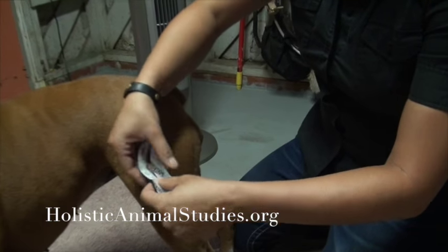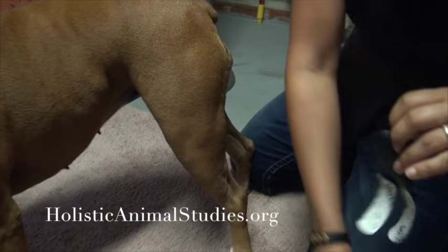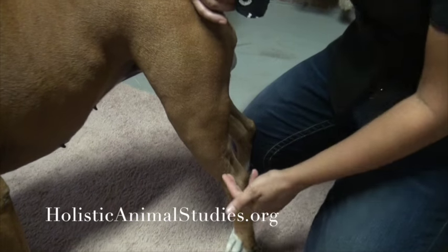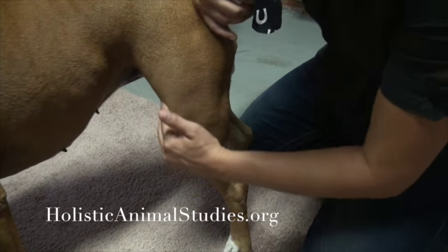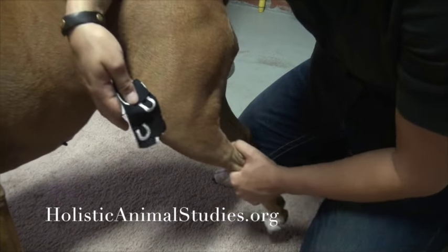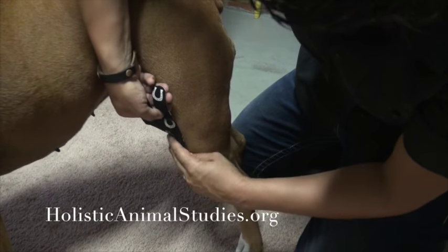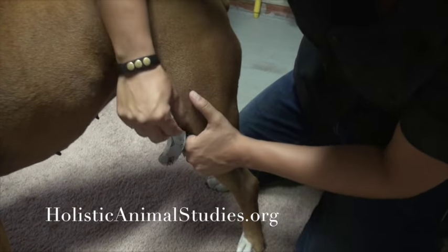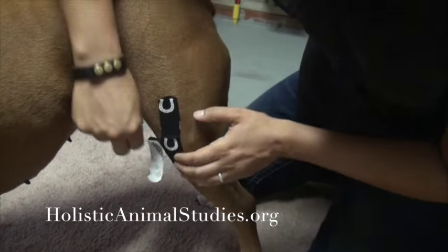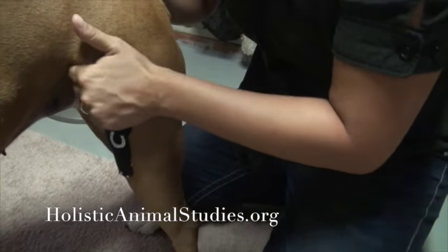We're going to tear it down at the base, take the paper off on this bottom base part, and lay the base. Now the knee of the dog — a lot of people think it's down here, but this is actually the ankle joint. The knee is up a little bit higher, so if we bend her leg, we can actually see where that knee joint is. I'm going to place this basically right over that knee joint, and then take these two Y's and hug it going up along the leg. I'm going to do one on the inside. So that's our first piece.